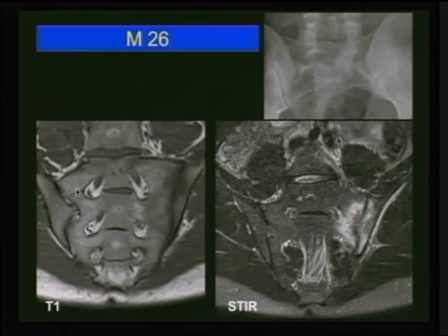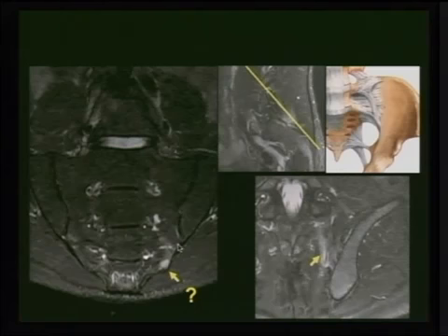The other patient is on the other side. This one is low signal intensity on T1 weighted and bright signal intensity on the T2 fat sat or STIR images, and you can see them as well on the plain film. They are very normal; no abnormality is detected at all. What we say here is that there is a focus of bright signal intensity on STIR, which means it is an edematous change, which was low signal intensity on T1. How can I explain that this is arthritis? There is not much joint space in here. So what is the explanation for this?